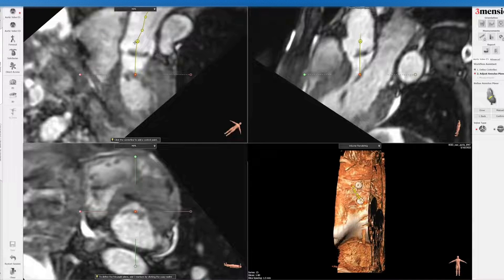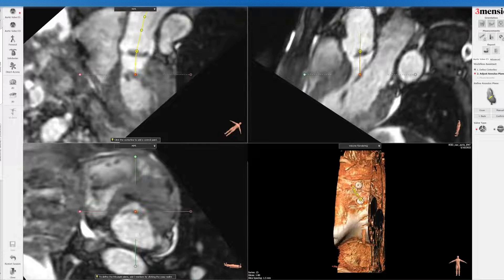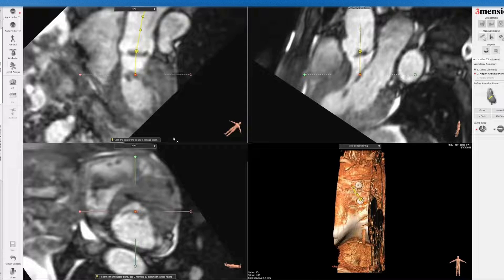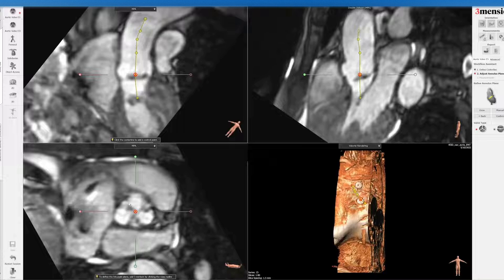Remember, this does not have calcium shown here — this is an MRI study. But you can see the calcified leaflets in the form of a black line, and that's how you can determine the annulus.